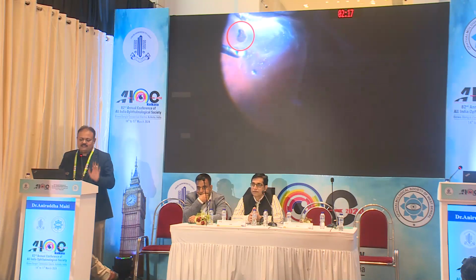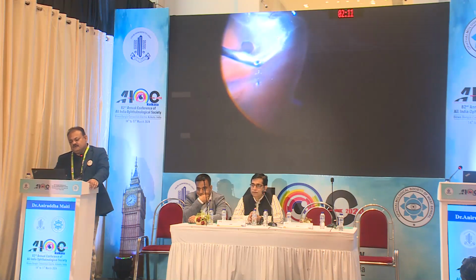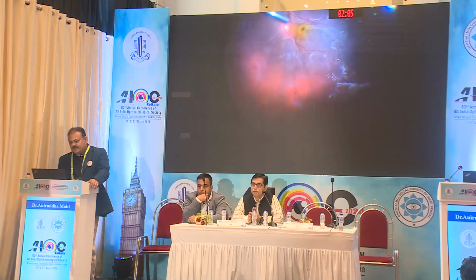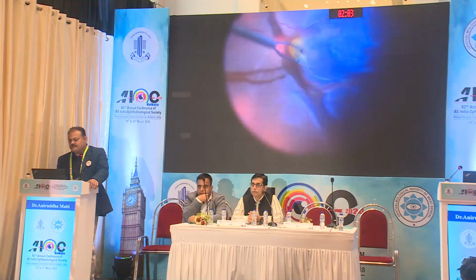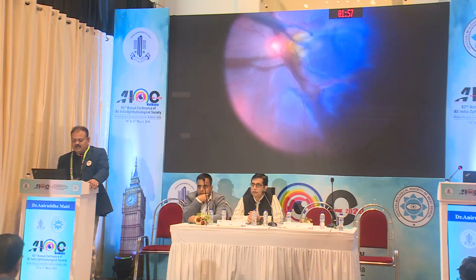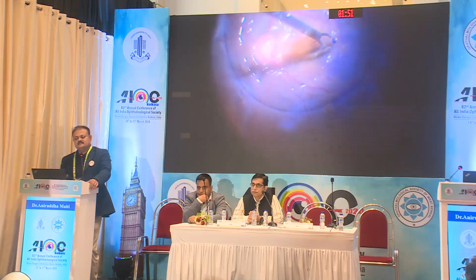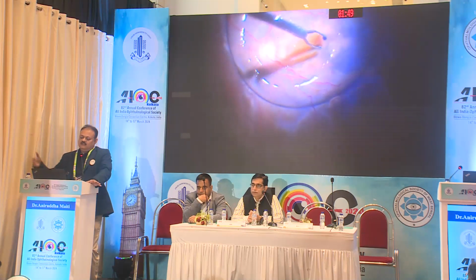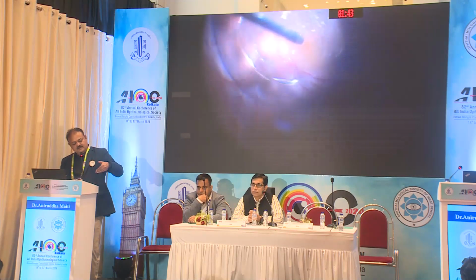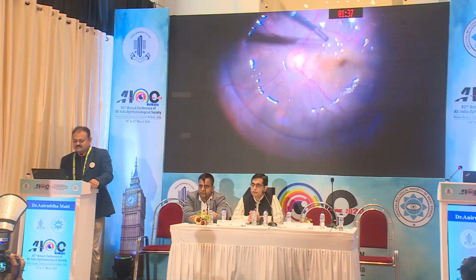Yes, this break has happened because the vacuum was more. It is always better to reduce the vacuum, especially with the 20-gauge cutter, to prevent this. The other way to prevent it is to stabilize the retina and depress it with a depressor. Depressors we use in many cases, but depression actually makes that part of the retina stable. The chances of an iatrogenic break are less.